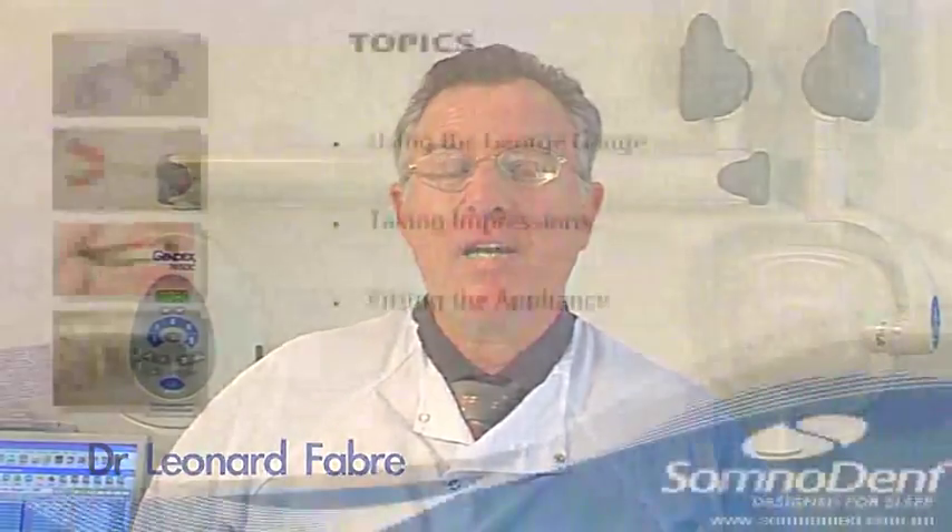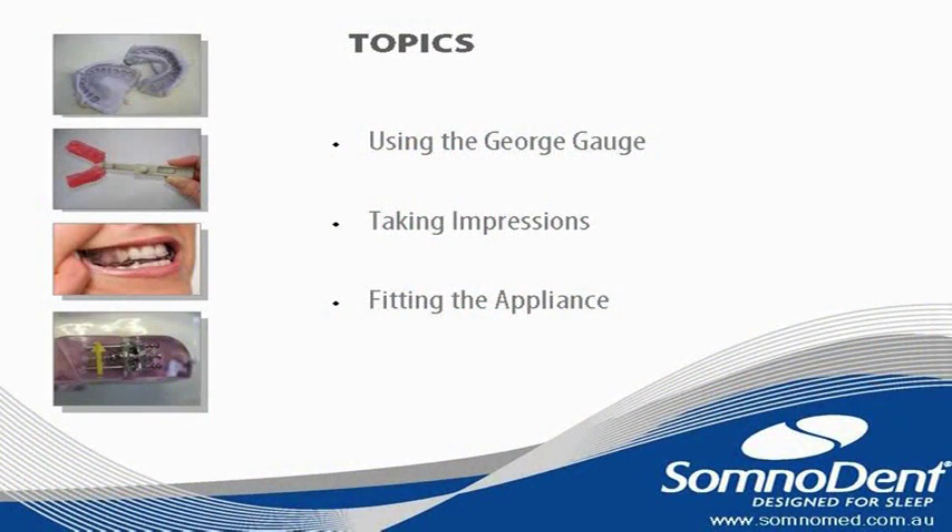Hi, I'm Dr. Leonard Fabre and I'm going to demonstrate the bite recording techniques and the impression techniques for the Somnomed mandibular advancement splint.